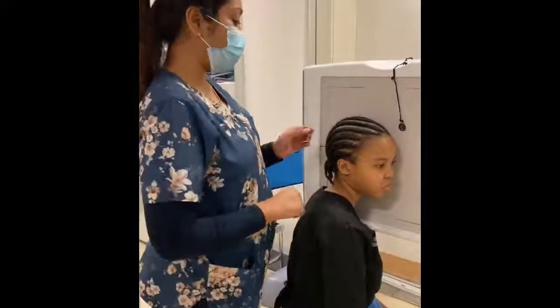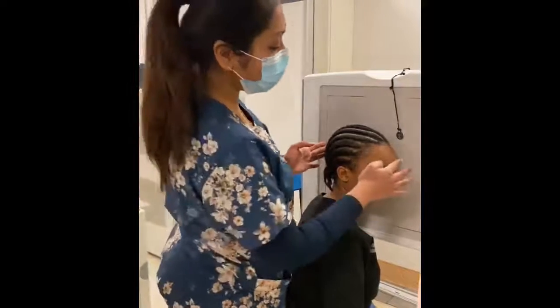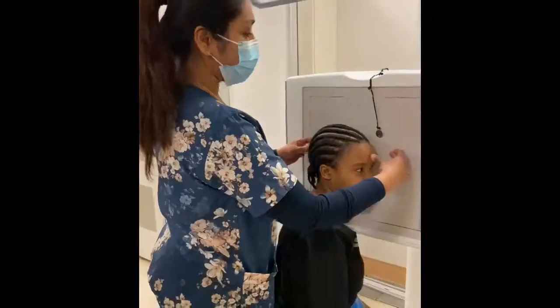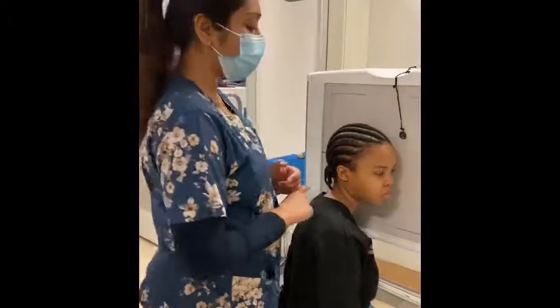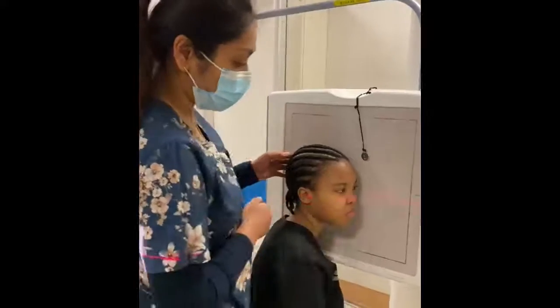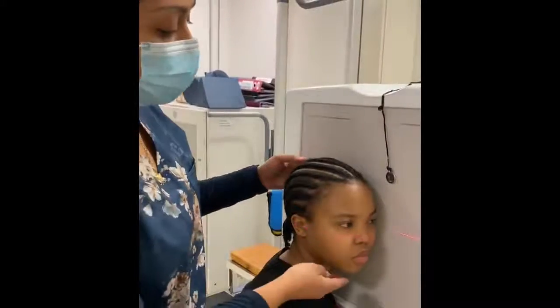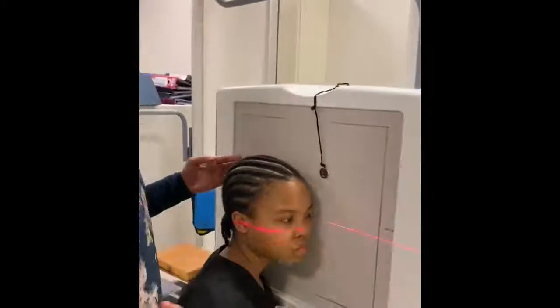So what can we use? We can use your occipital protuberance posteriorly, and we can use the glabella or the nasion anteriorly, and just make sure that the distance is equal on both sides of the patient, anteriorly and posteriorly. Then we're going to use our radiographic lines. Your interpupillary line needs to be perpendicular to your image receptor. Then we can adjust the patient's chin so that the IOML is also perpendicular to your image receptor, and we need to make sure that the mid-sagittal plane is parallel to your image receptor.